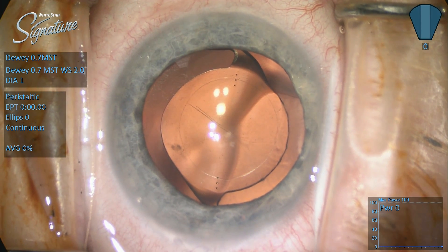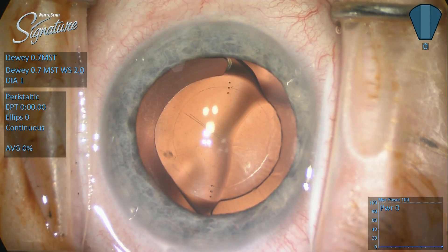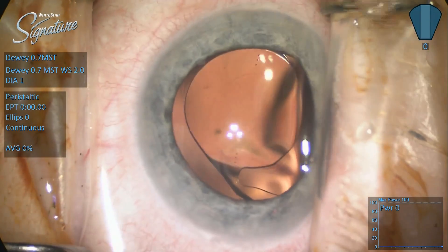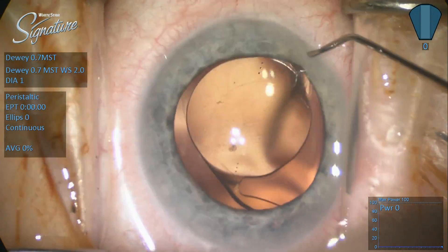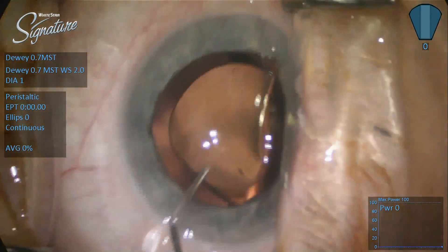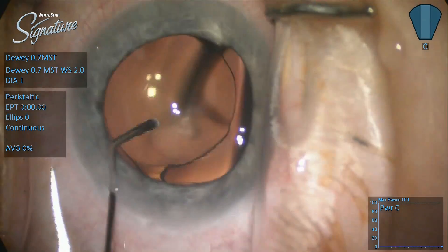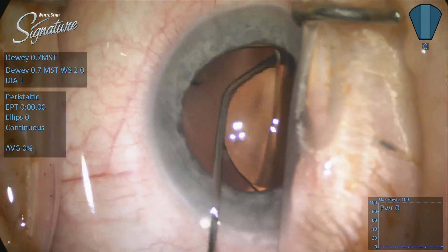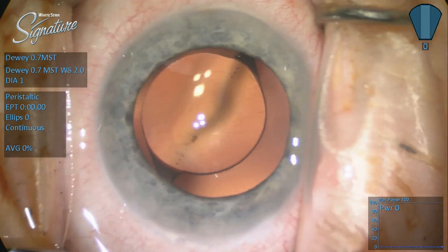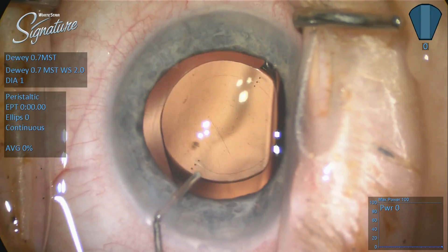Here we've already put viscoelastic into the anterior chamber. We've reopened the side port incisions both towards the 7:30 position, as you see there, and towards the 1:30 position, as you see up here. I normally rotate the lens using only BSS on a 5cc syringe — the purpose there is to not put viscoelastic into the anterior segment because we want to improve the adhesion of the lens to the capsule and we don't want to cause a pressure spike. But in this case, we had slightly different plans.